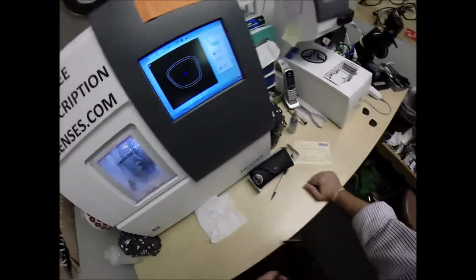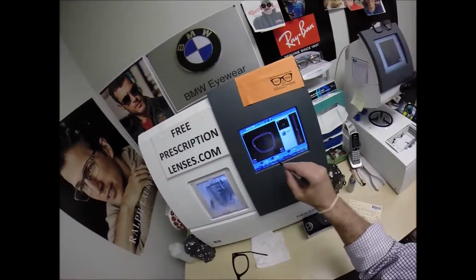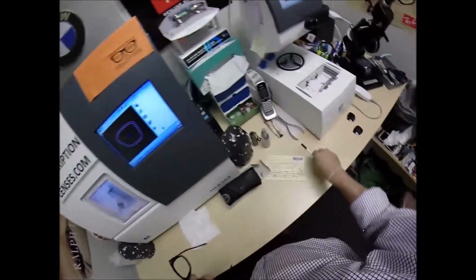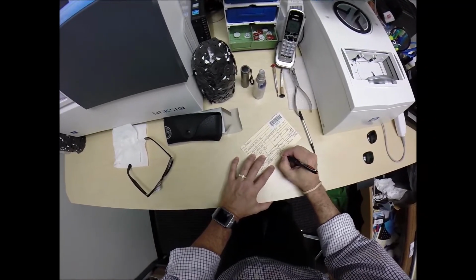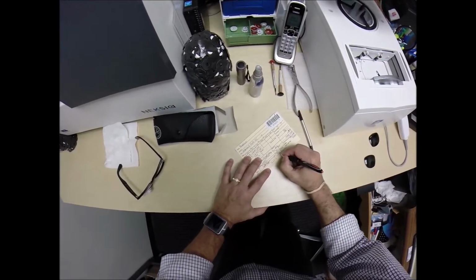Of course it's going to ask me where to place the bevel again since I told it to, and we're going to do the same thing. And one thing I'm going to do, I'm going to make a note that I cut on 1.2 millimeters front base curve. I write it in red so it jumps out at me.